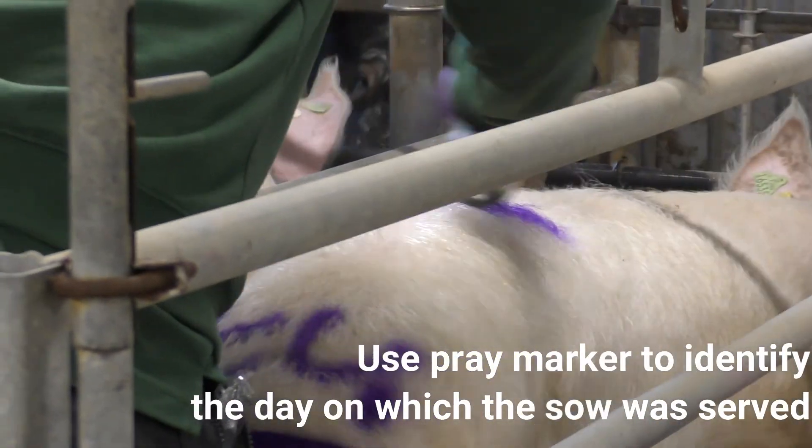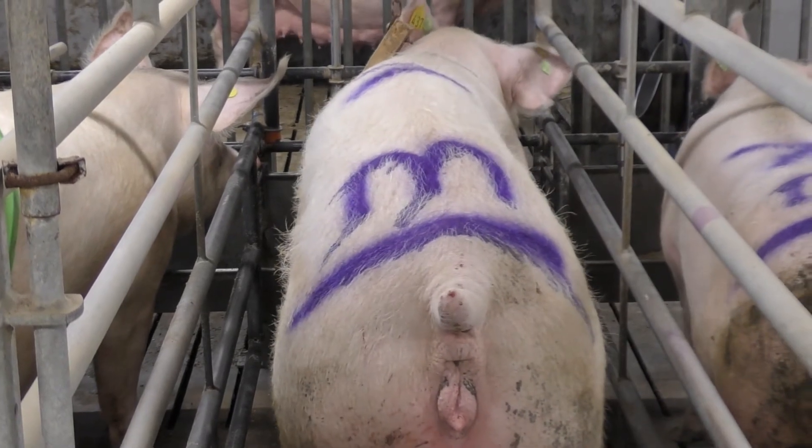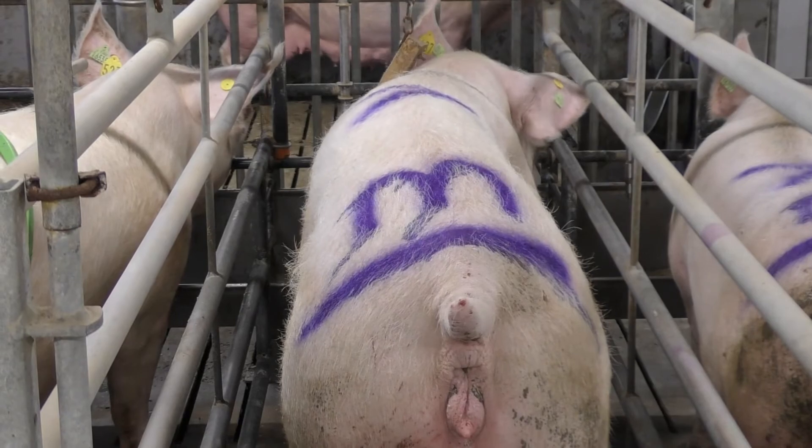Remove the catheter by unlocking it from the cervix and withdraw it carefully. After insemination, leave the sow for at least 20 to 30 minutes undisturbed in quiet surroundings.